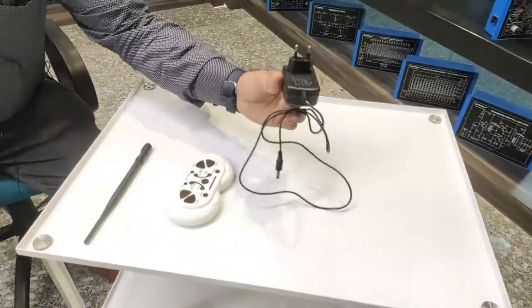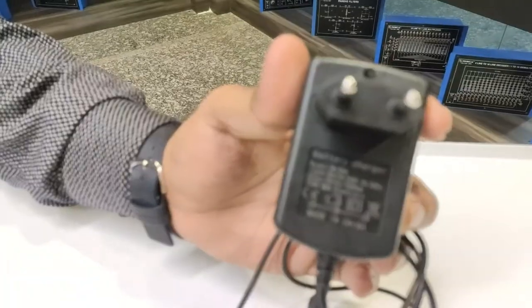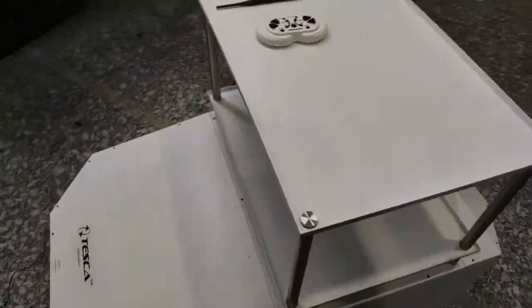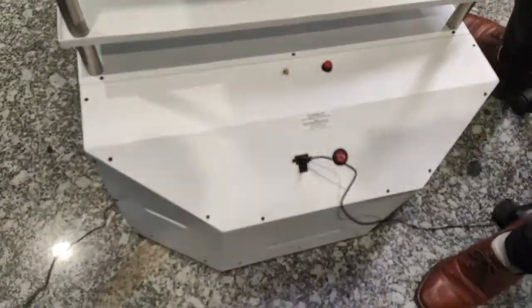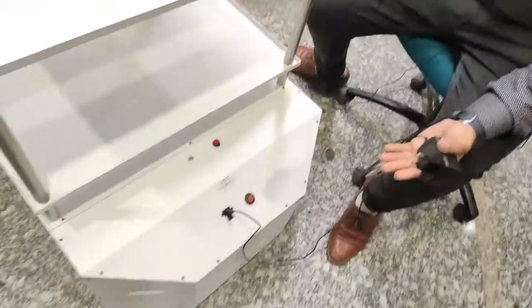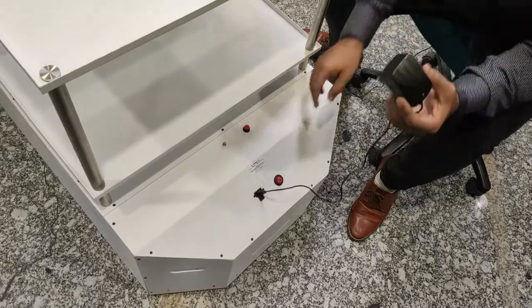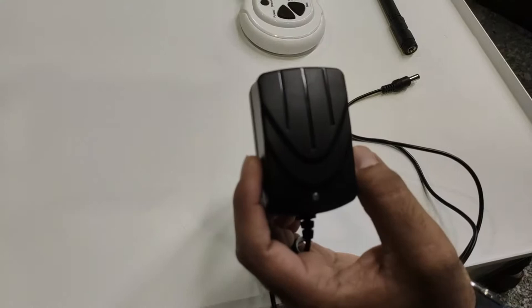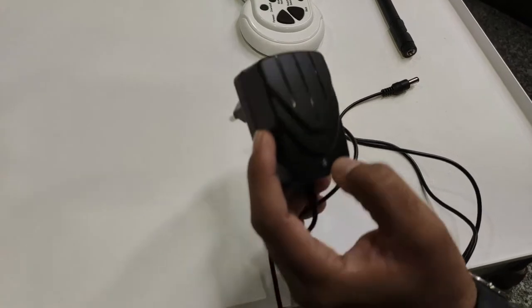The machine works on a battery, and the battery can be charged with this 12-volt power adapter battery charger. The battery charger will be connected to this port and it will take around one and a half hours for a full charge. There is also an LED behind the charger — it glows red while charging and indicates a green signal when charging is done.